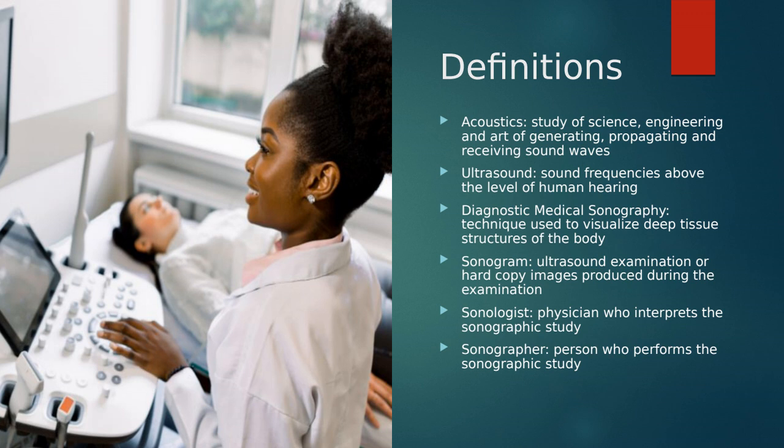A sonogram is the type of examination that we're performing. So these are the images that we're taking per exam. There are dozens of different types of sonograms. We're going to learn all about them this semester. You're going to see them, and you're going to be performing them when you start clinic in the spring. But an actual dedicated exam, depending on the clinical indication, is referenced as a sonogram. We don't typically use that word too much. We just say exam or procedure or test.